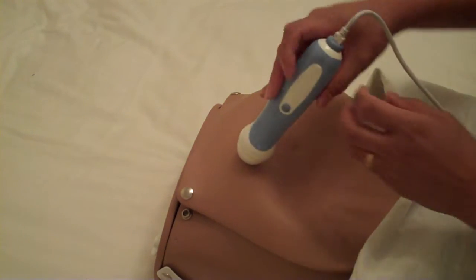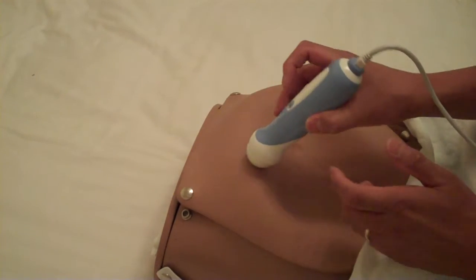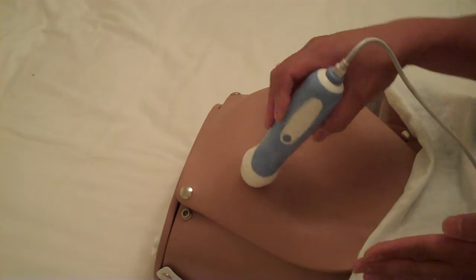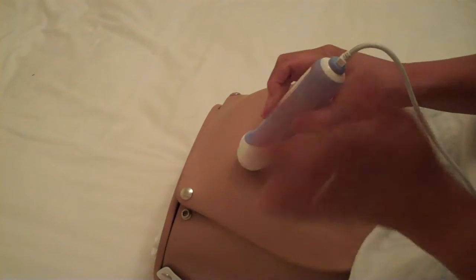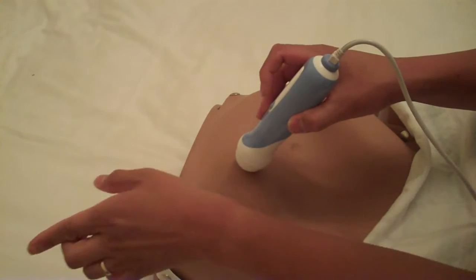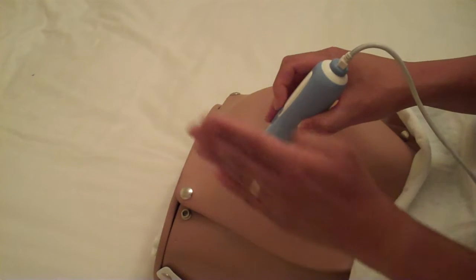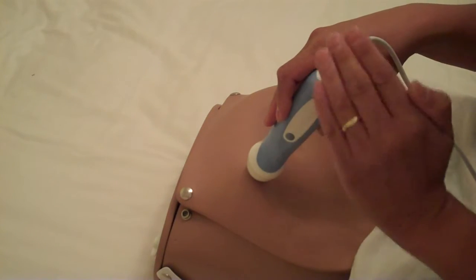If you start turning in all sorts of different directions, it gets very confusing and you don't know what you're looking at. So either keep it looking up or to the right, this way, in between. You do not want to go all the way around like this, okay? That's just a convention. Because the dot, remember the dot on the screen is always on the right side. Now the view, the image that you get from going from here to here, even though you're looking at the same thing, can change completely.